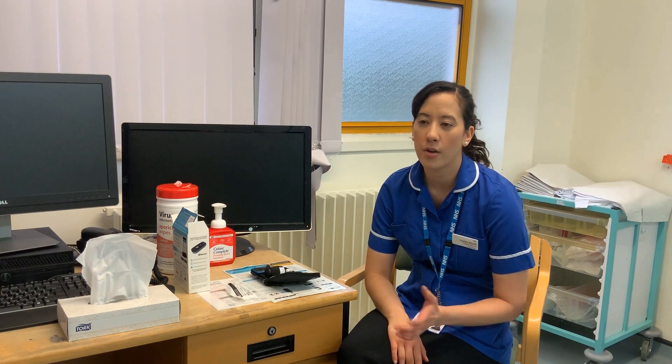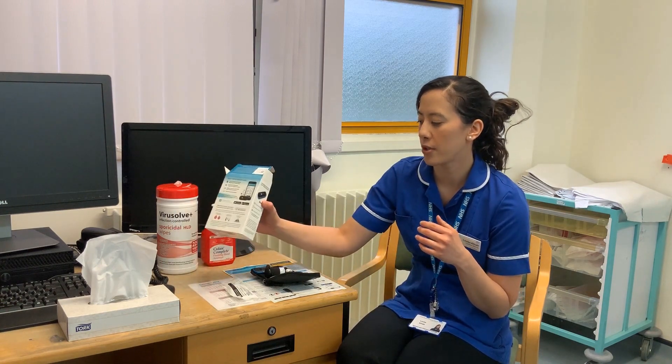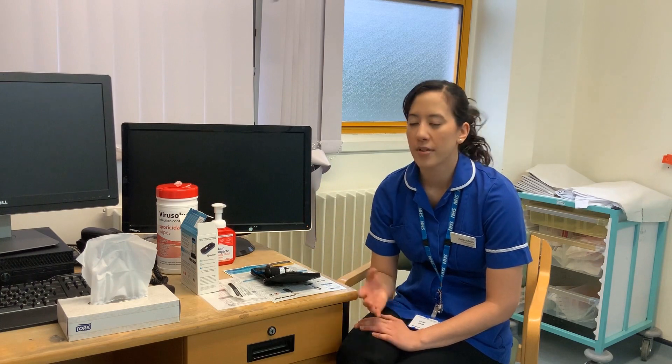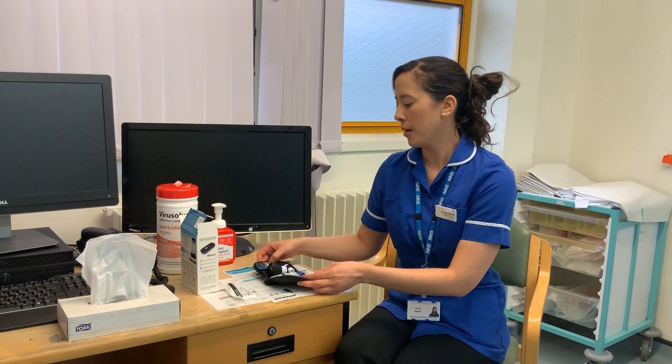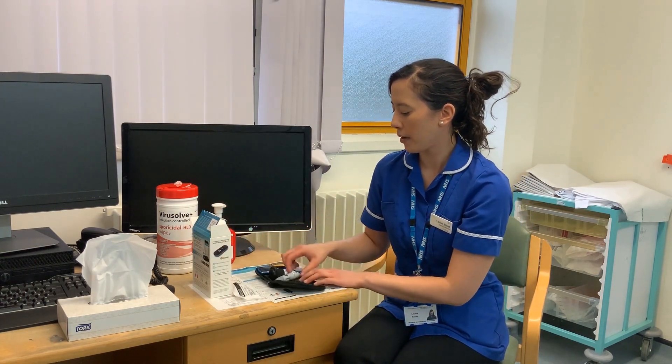Following your diagnosis, we will ask you to come and collect a pack. In that pack, you'll be given a box which contains your meter and various leaflets that you will need. We will also give you our contact details so you can contact us at any point, and we will obviously support you any time. In your pack you've got your kit.